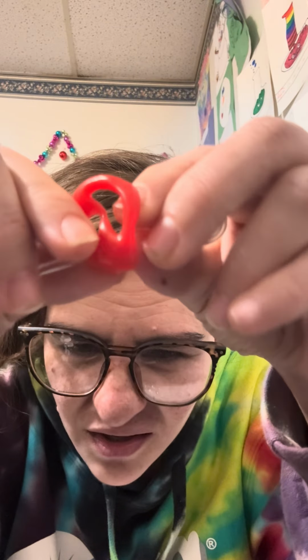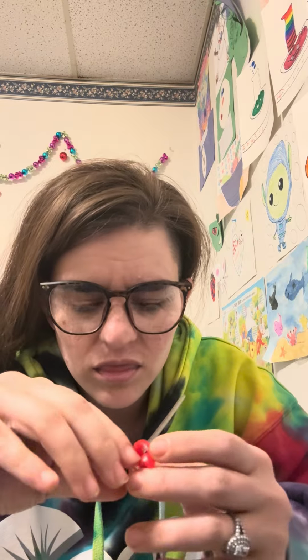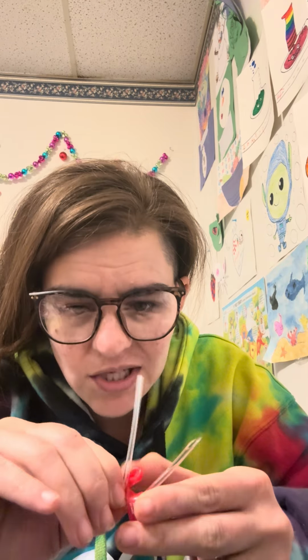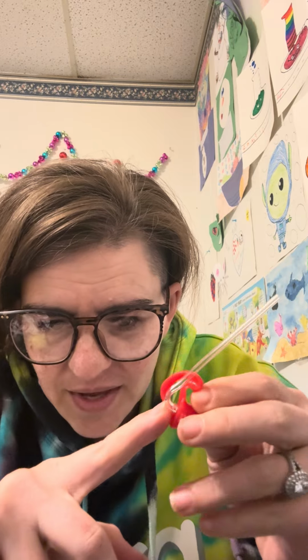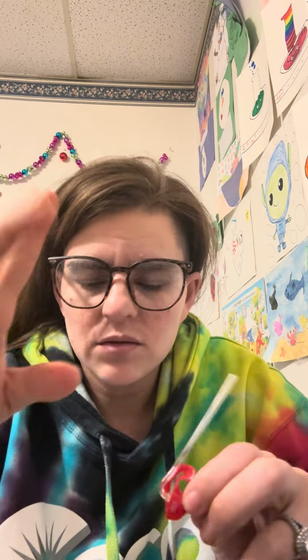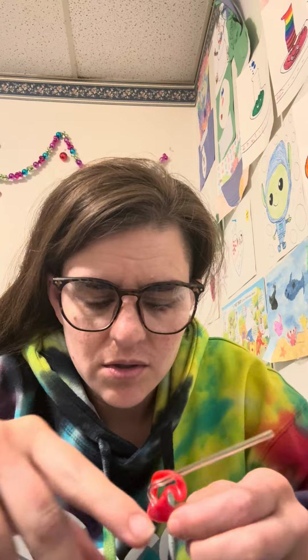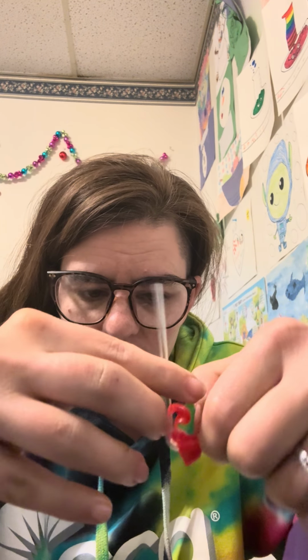Now, for me personally, I need to pull it in a little bit more because you see the lock. I don't know if you can see that, but see that plastic bit? The lock's not in all the way, which I can just pull that in a little bit. So, according to my audiologist and almost every audiologist, you need to keep it at a 90-degree angle. So don't pull this bend in all the way because that can obstruct some sound. So it's like an antenna. You have to have it at exactly the right angle. So I'm just going to pull that lock in, okay? And I don't want to pull the bend in. You want to leave the bend out. So there's my 90-degree angle.